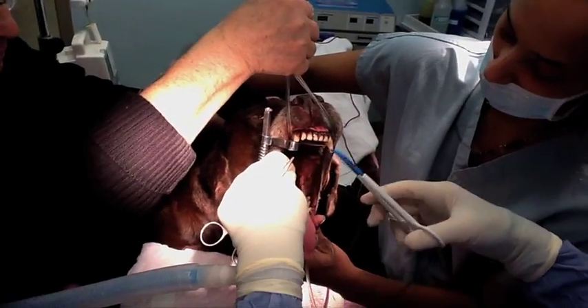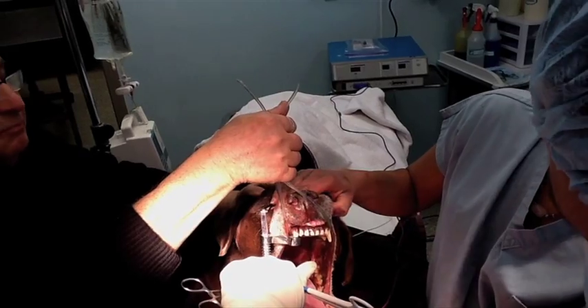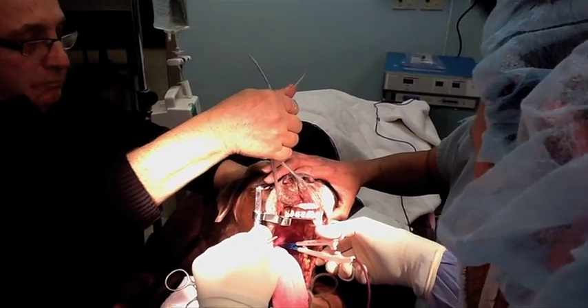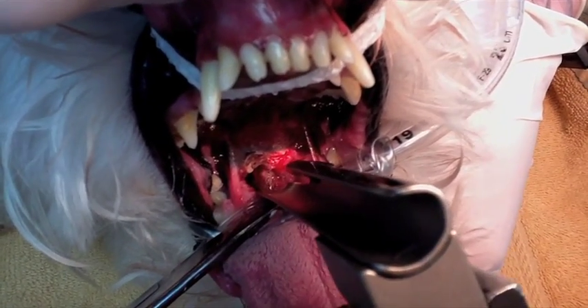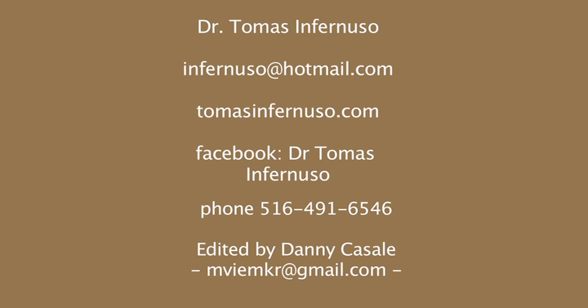After the removal of the soft palate, the portion of soft palate that is left in the oral cavity will contract by second intention healing, creating a smooth surface and preventing any interference with the airflow. The second case is exactly the same procedure but performed in a large breed, and finally you can appreciate how the opening of the airways of the oral cavity is obtained.